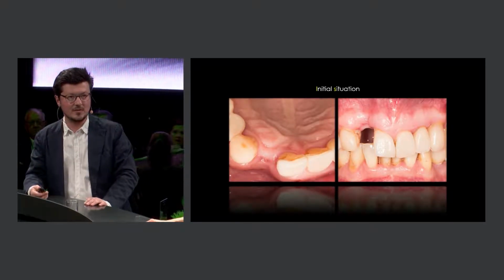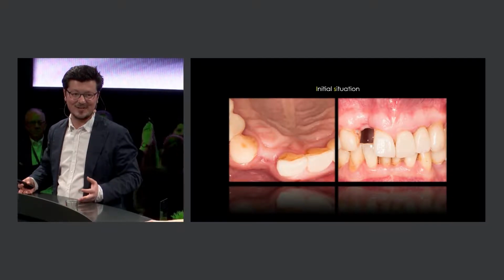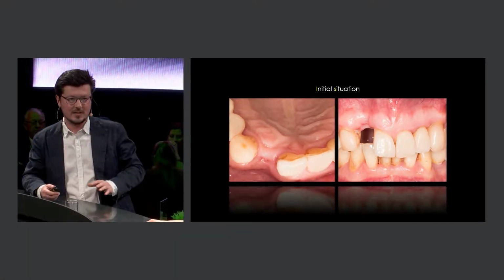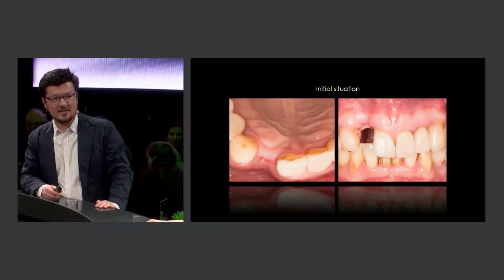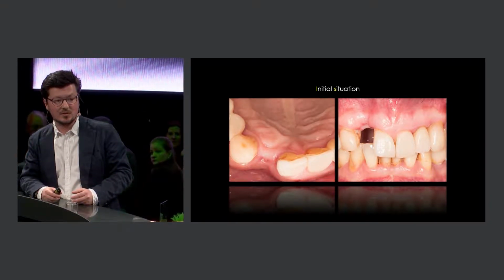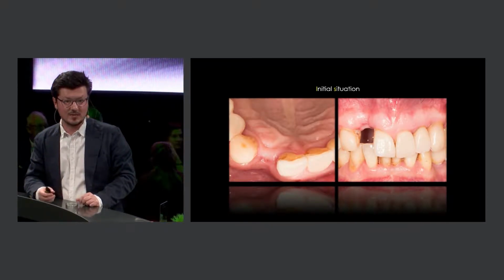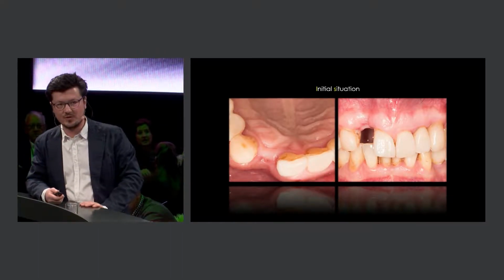And this is the case, the initial situation. All this case was done with my colleague and friend Alexei Rabov and with dental technician Claudio Ramo. I should give credit to them. You can see this case with severe bone atrophy and soft tissue atrophy, both horizontally and vertically. Not an easy case. The patient had the lateral incisor removed about 3 months before at another dentist, and then he came to me. This is a type 3 implant placement according to the Chen and Buser classification, so we definitely require some GBR and soft tissue management procedures.